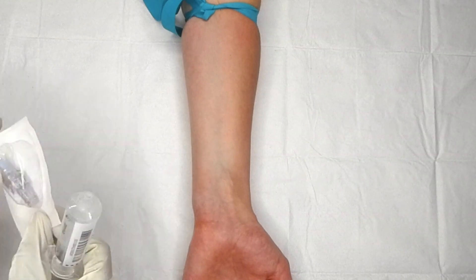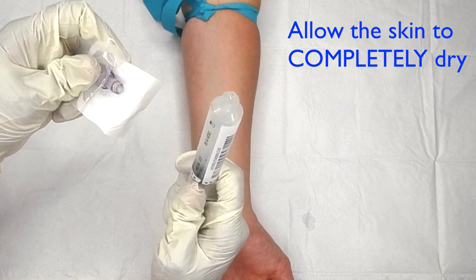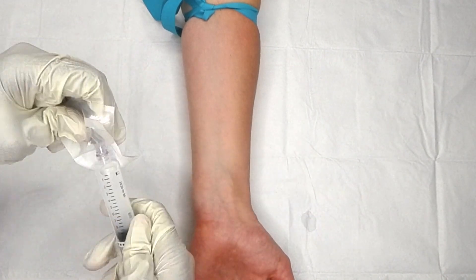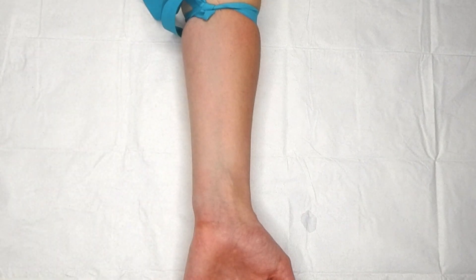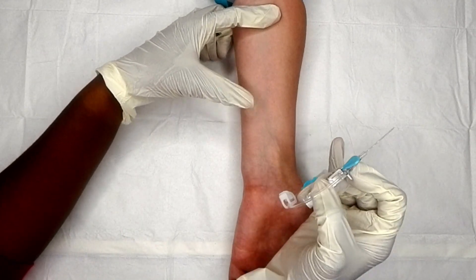After I cleanse the site for a full 30 seconds, I allow it to fully air dry. If you insert a needle into wet skin, you will run the risk of giving your patient an infection and you will lose that IV due to bacterial phlebitis.